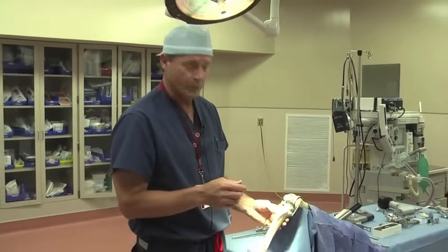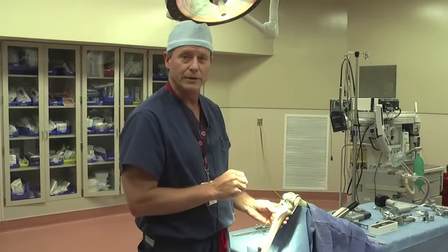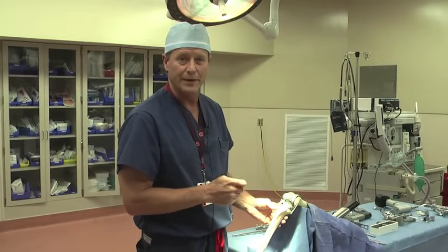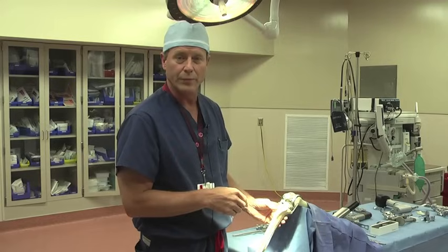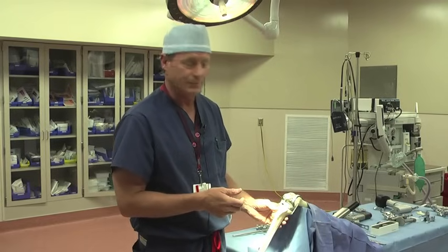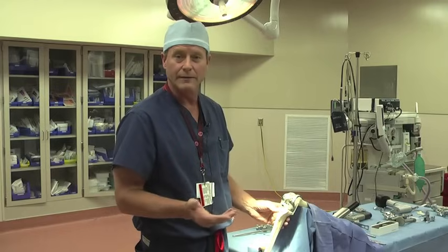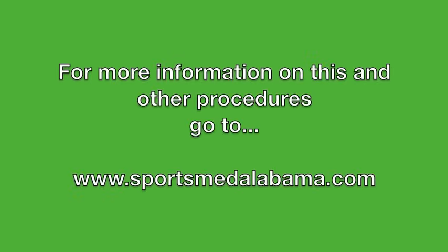At this stage we'll remove all the trials, open up the final implants, wash off the bony surfaces well, and then cement those components on. The cement takes about five minutes to harden and then we're basically finished, and we'll close up the wound at that point. Essentially this operation takes about an hour to an hour and 15 minutes. That's basically how the total knee replacement is done with the dry bones model. For more information on this and other procedures, go to www.sportsmedalabama.com.